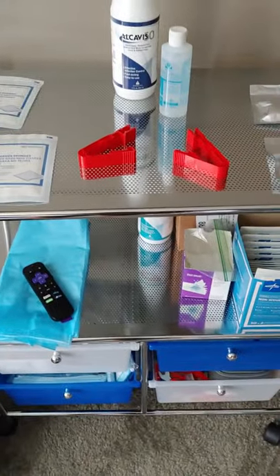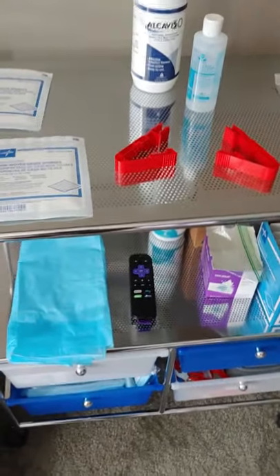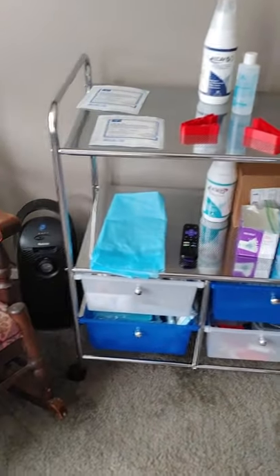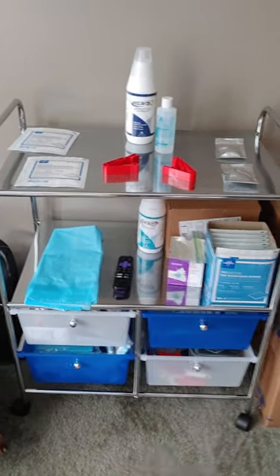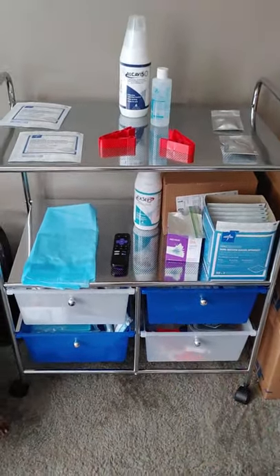I wanted to show you real quick a little bit of the setup I do right before I do my exchange. I actually just paused my TV, so that's why the remote is there — it's usually not there. But this is my cart that I use. I love it. It's on Amazon. I think it was about $60, but I think it is absolutely wonderful and totally a necessity.